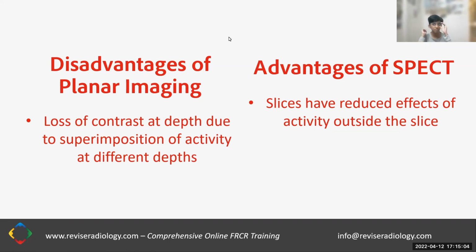Just think about it this way. We know that everything that comes in contact with the radionuclide becomes a further source of radiation. So when the radiopharmaceutical has been administered to the patient, think of all the points which have become sources of radiation as glowing points. Imagine you're imaging the liver, for example.